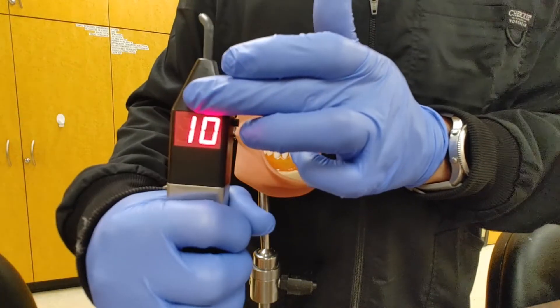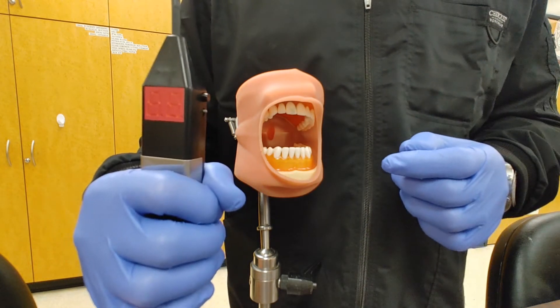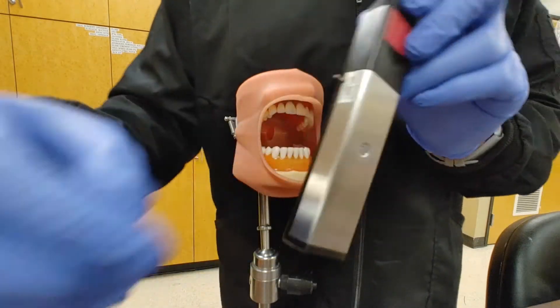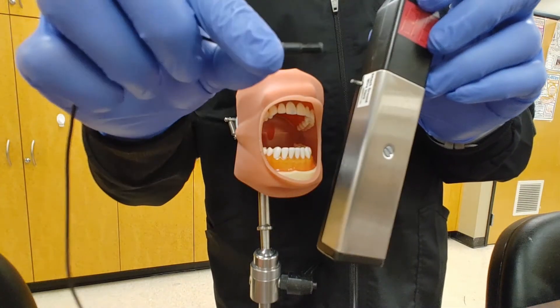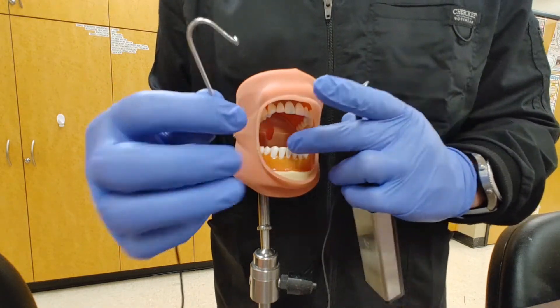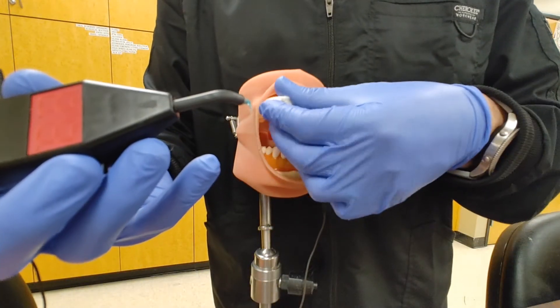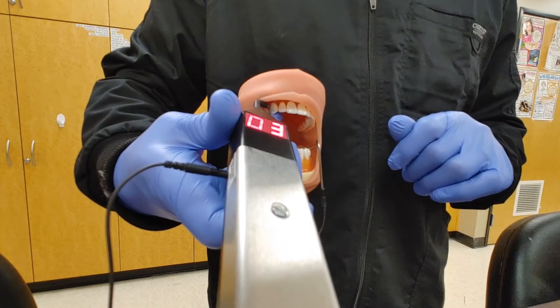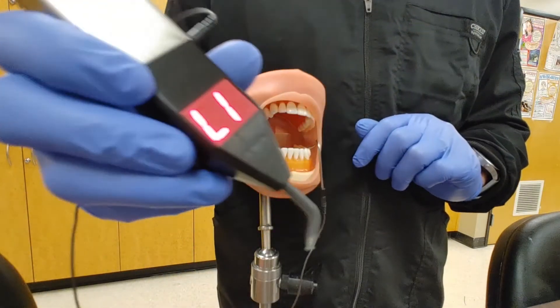The number that appears on the screen is what we record. Do the same test on a couple of neighboring teeth and the control tooth on the other side. If you don't want to give control of the device to your patient, there's also a method where a wire and hook can be attached to the side pin. Attach the wire and hook and place it on the opposite side of the tooth you're testing — such as if testing the right side, hook the left cheek or lip. Dry the tooth and neighboring teeth, inform your patient to raise their hand to stop the shock, then take your readings and record them in the patient's file.